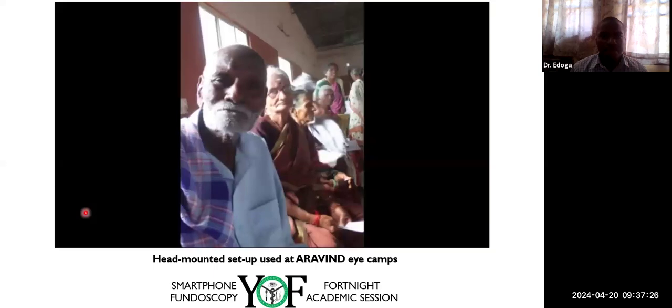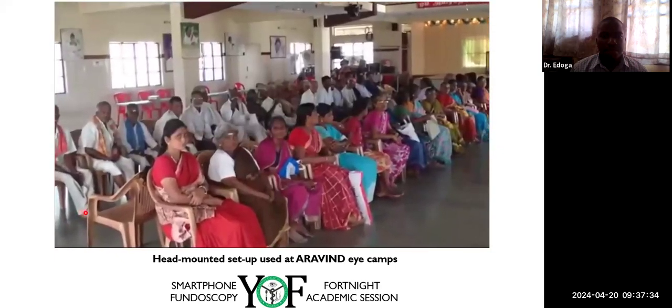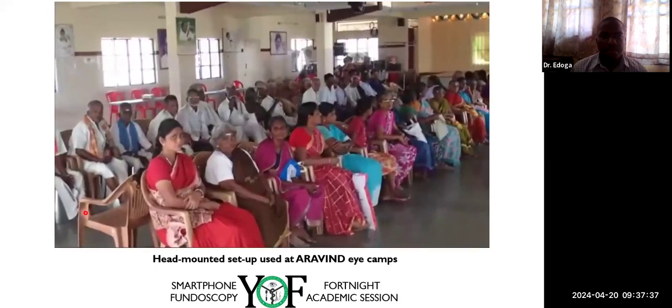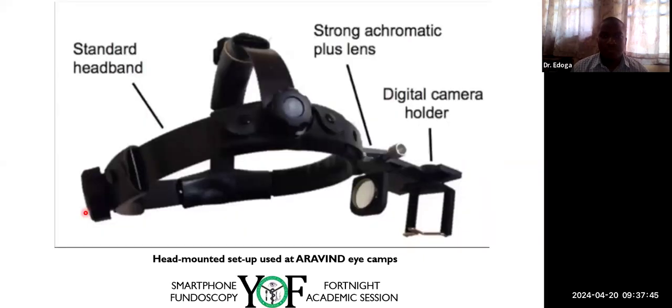Many ophthalmologists in the developing world cannot afford an indirect ophthalmoscope, and forego the indirect ophthalmoscopic exam. There is a need to develop a highly affordable and portable indirect ophthalmoscope. Smartphones present a possible solution to this need. We have developed an inexpensive indirect ophthalmoscope using a smartphone that functions surprisingly well.